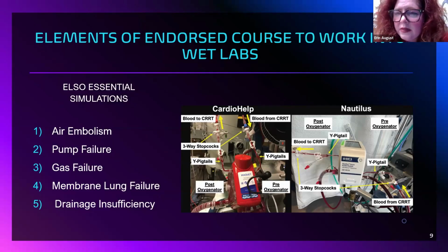Practicing these wet labs and simulations, again, builds your confidence. So is that something you choose to do, that your team is more comfortable? Because it's really ideal if we can. We know we can't always, but if we can plan, if we're going to change out an oxygenator versus having to do it emergently, and see how well the patient can handle that type of situation.